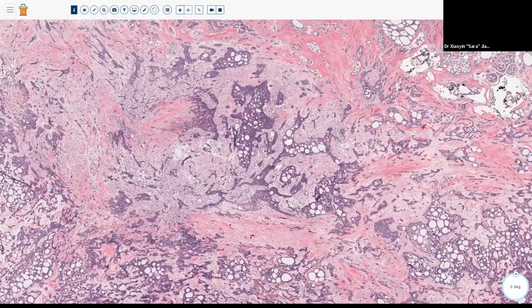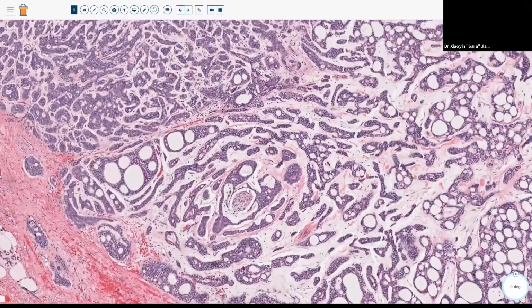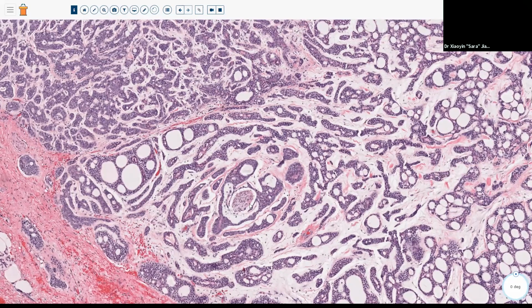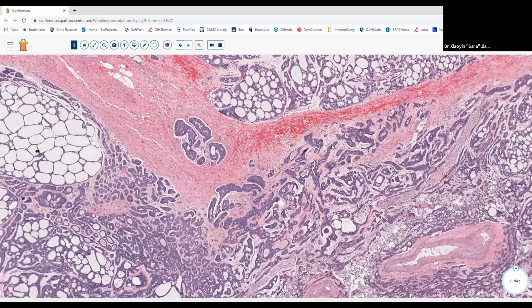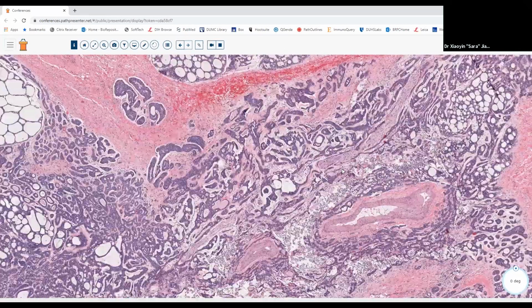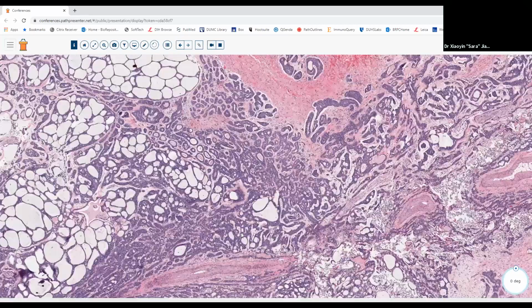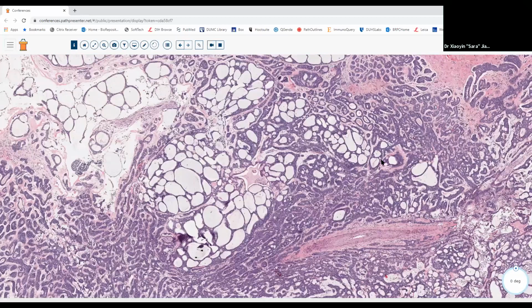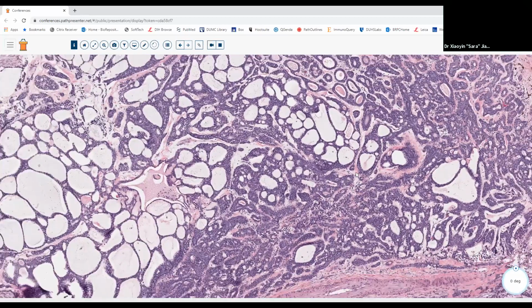And that's very characteristic of this tumor. The other thing that we've been kind of seeing is that periodically, what's this? Got a little nerve, and we've got some more nerve running in cross section, and the tumor is just wrapping right around those nerves. So prominent perineural invasion, multiple patterns, including a prominent cribriform pattern.